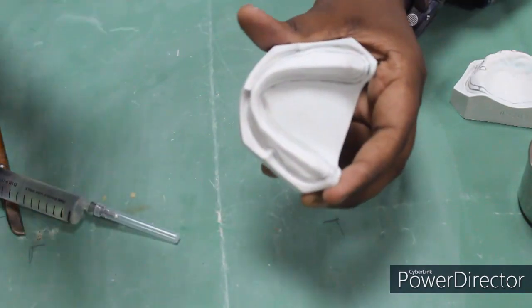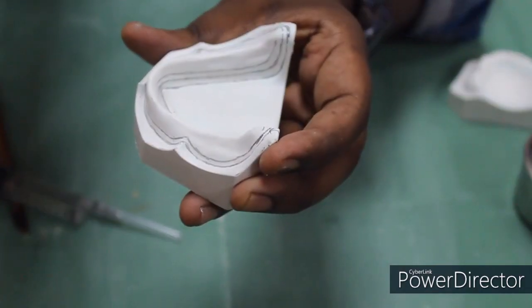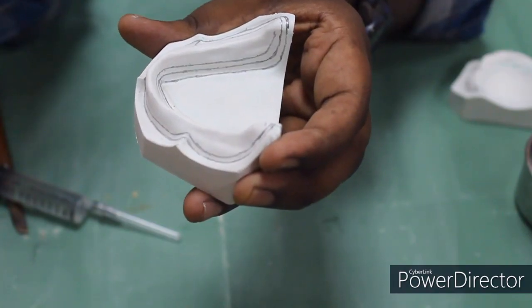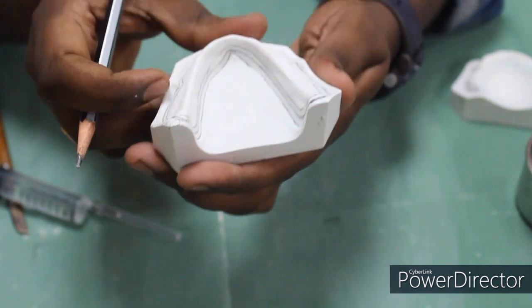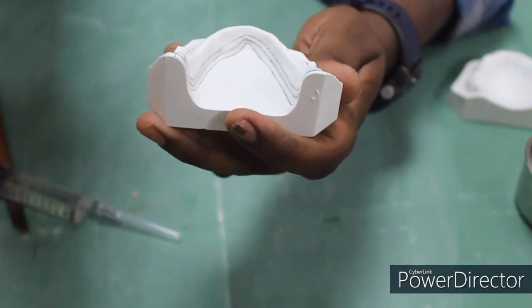Similarly, this has to be 2 mm short from the tray outline, the proposed tray outline, and it will be 4 mm short from the depth of sulcus. So I have completed it for the lingual side. Now I am going to extend it for the labial aspect.